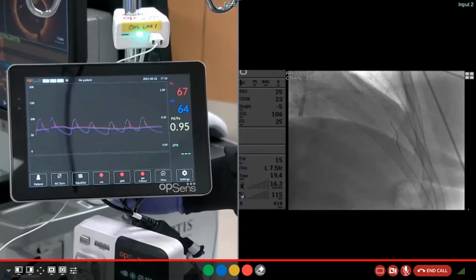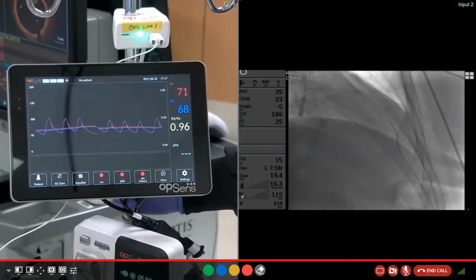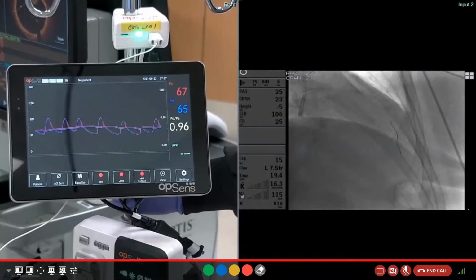But it's not unfeasible to see that right now our CAT scans are so good. You can do a CAT scan, find a severe lesion in a diagonal branch, plug that into the robot, and the robot could actually end up doing it for us at some point. But right now it's still something that we're doing by hand, but it's really quite natural once you get used to it.